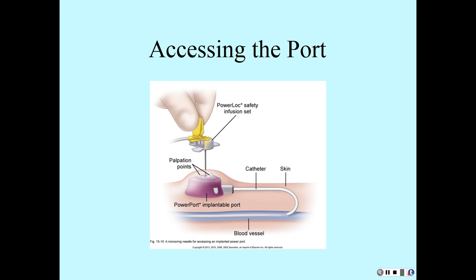Now, if your patient is home, the nurse will come in, access it, do the procedure, give the medications, and then once she leaves, she'll flush it and then take the needle out. Yes, you flush. Any tube like that, you flush before to make sure it's patent, and then you flush after. And then heparin. You leave heparin in it.